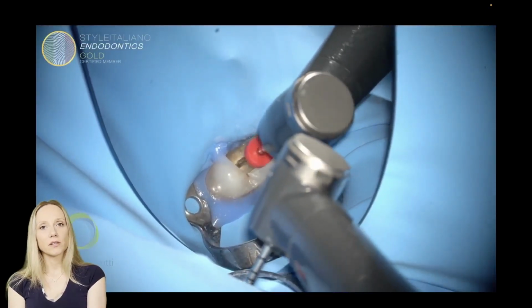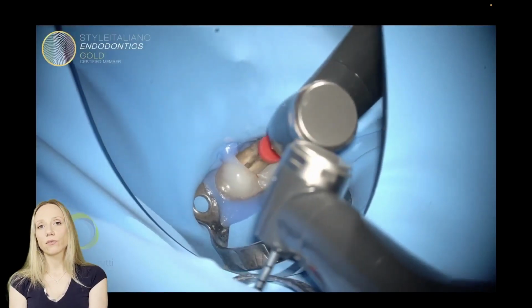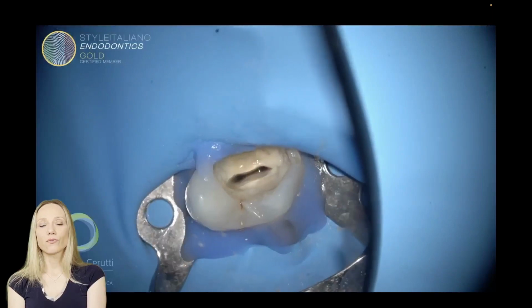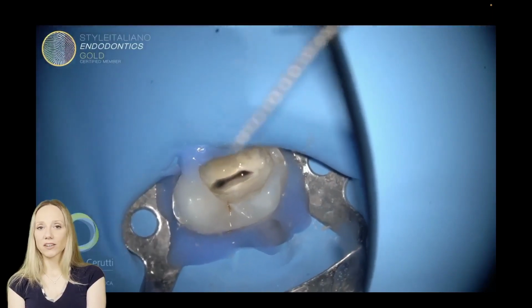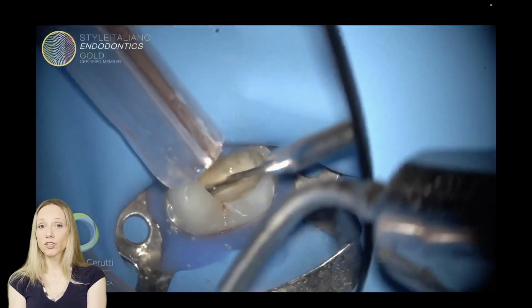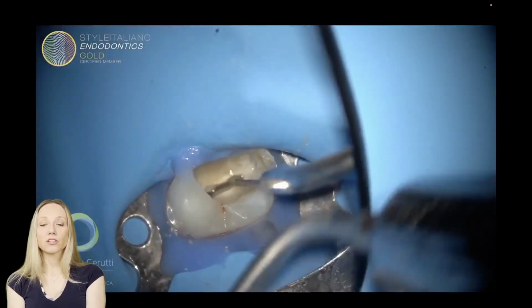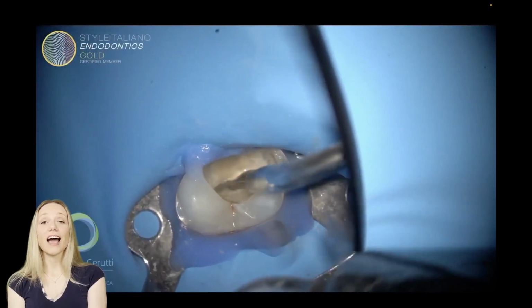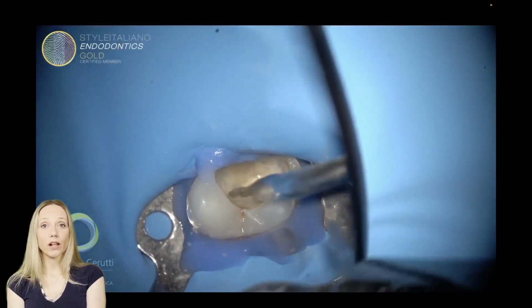In this case, when I remove the file from the root canal, I check the spires, and if I see fresh white dentine on the spires of the file, there is no need to enlarge more. It's a visual gauging procedure. So what do I do? I do the irrigation, and I activate the irrigant with ultrasonics.